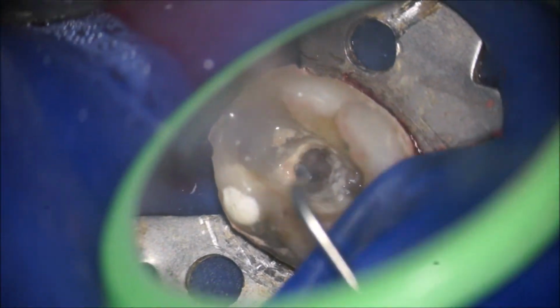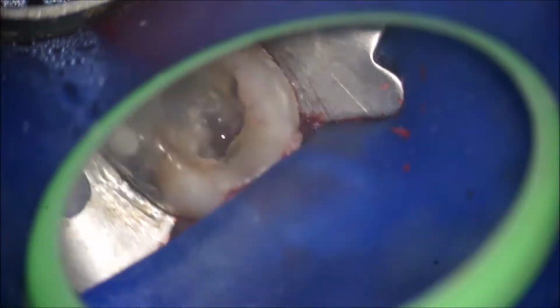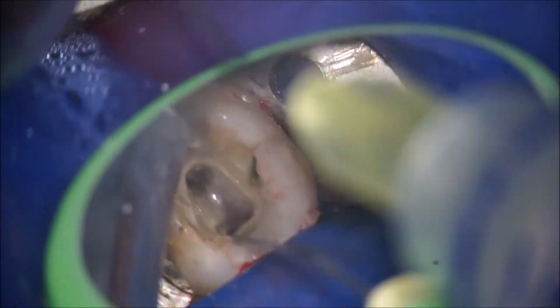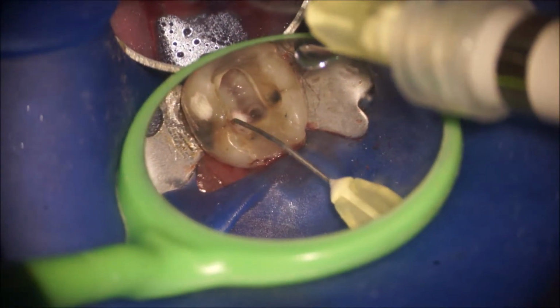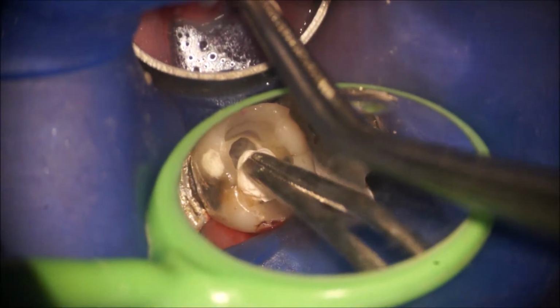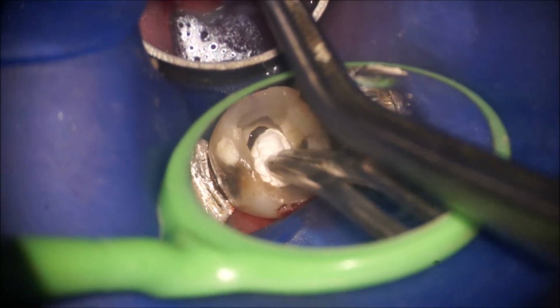I left the canal flooded with sodium hypochlorite, the idea being that the organic matter in this fibrous tissue would be thoroughly dissolved, enabling the easy removal of the resorptive tissue. The mesial canals I filled with calcium hydroxide as usual, and as I said just now, sodium hypochlorite in the distal.